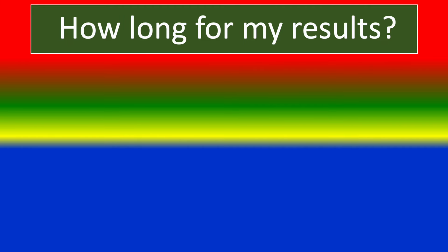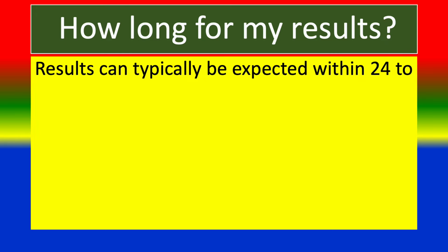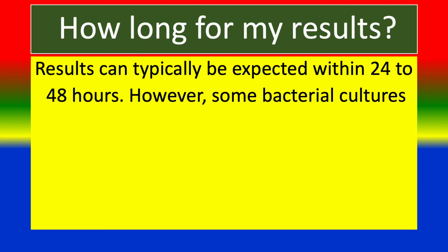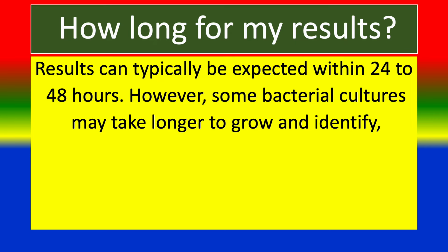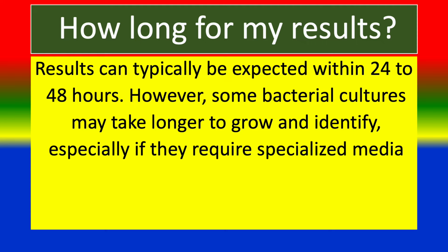How long for my results? Results can typically be expected in 24 to 48 hours. However, some bacterial cultures may take longer to grow and identify, especially if they require specialized media or conditions.